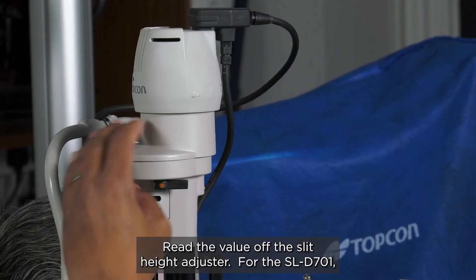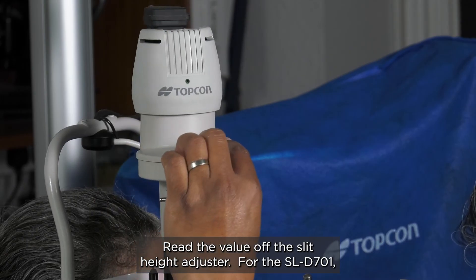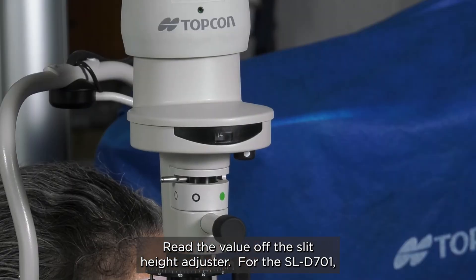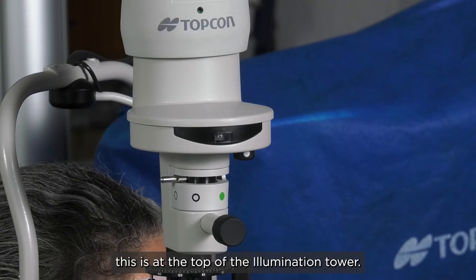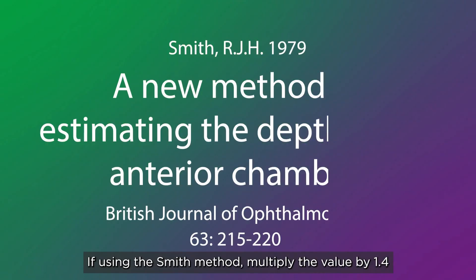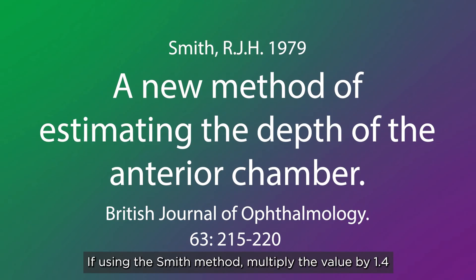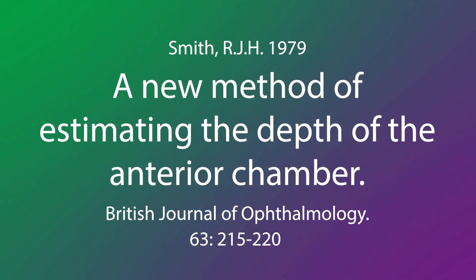Increase the slit height until they touch, then read the value of the slit height adjuster. For the SLD 701, this is at the top of the illumination tower. If using the Smith method, multiply the value by 1.4 to get an estimate of the depth of the anterior chamber in millimetres.